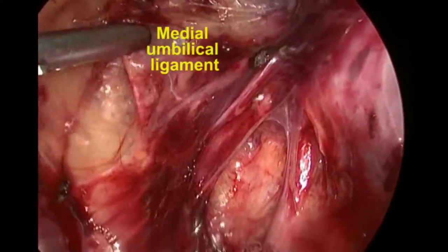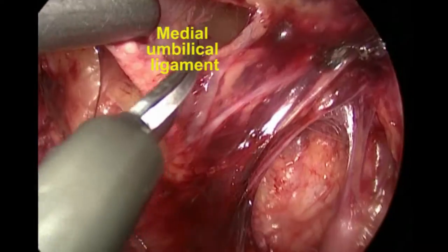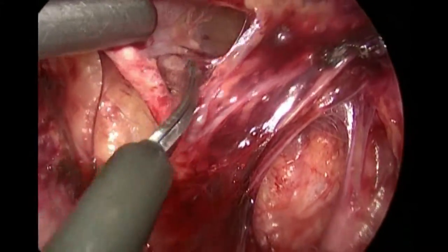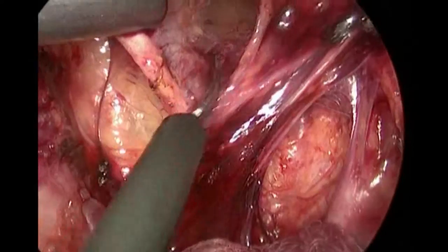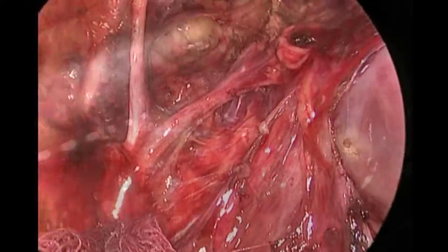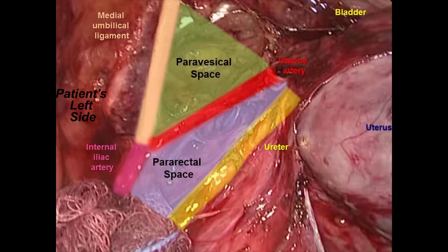The medial umbilical ligament is a landmark for the uterine artery and can be used as a handle to apply counter-traction to safely isolate the uterine artery.